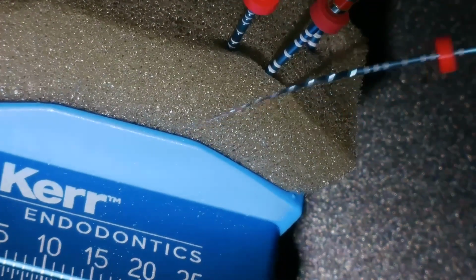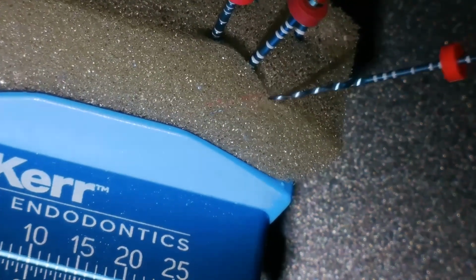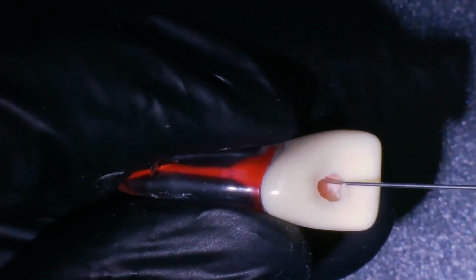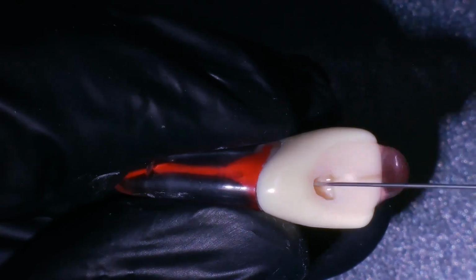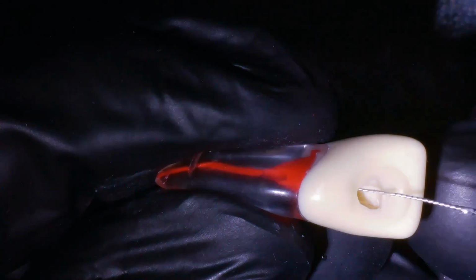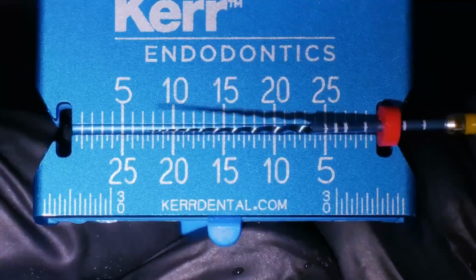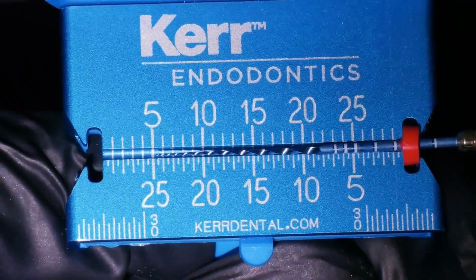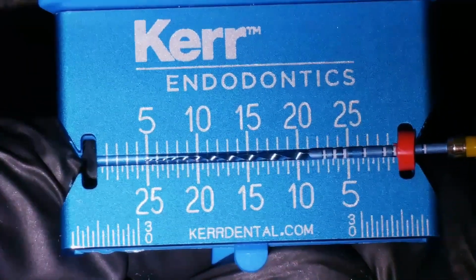Remember to wipe the file after each use using a sponge or alcohol gauze and inspect it for potential damage. Adjust the rubber stopper to the working length only after attaching the file to the handpiece to avoid any accidental changes by hand.